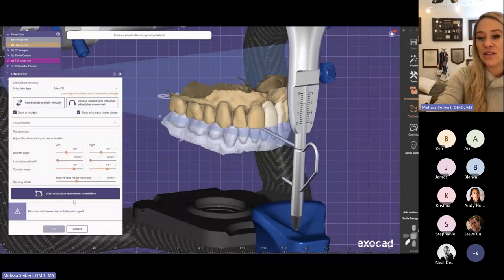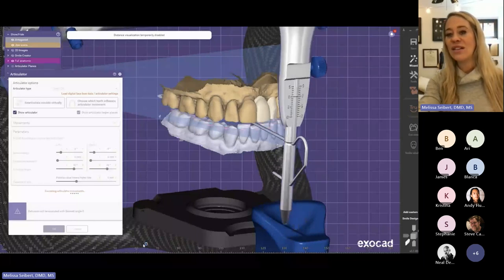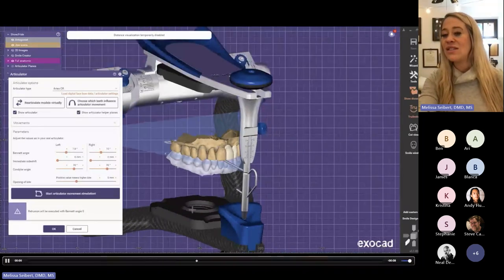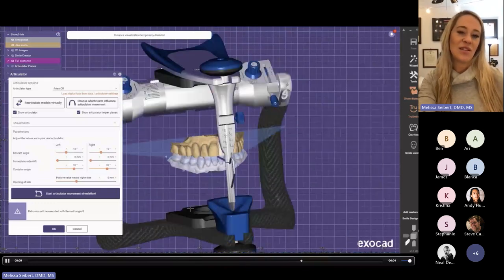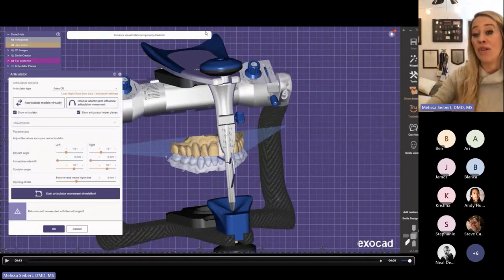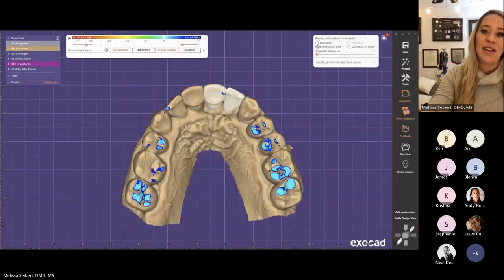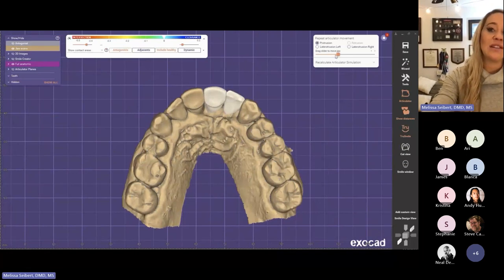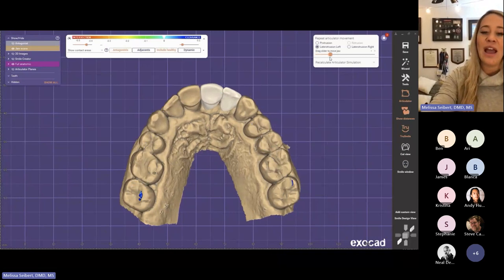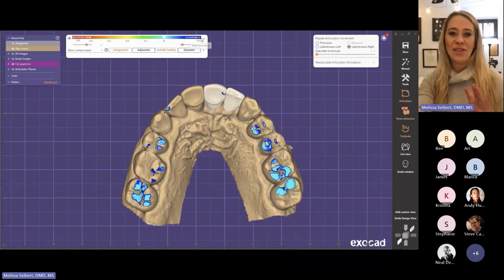The next step was loading this case into the virtual articulator, which is also very helpful because it takes a lot of the guesswork out and you don't spend as much time doing chairside adjustments. You can select just about any articulator — most major articulators on the market are available in this app. You can then print this and transfer it onto the articulator if you have one in your office. Using the different features, I'm able to do the articulation simulation — I can take it through lateral, left, right, protrusive — and determine if there are any interferences.